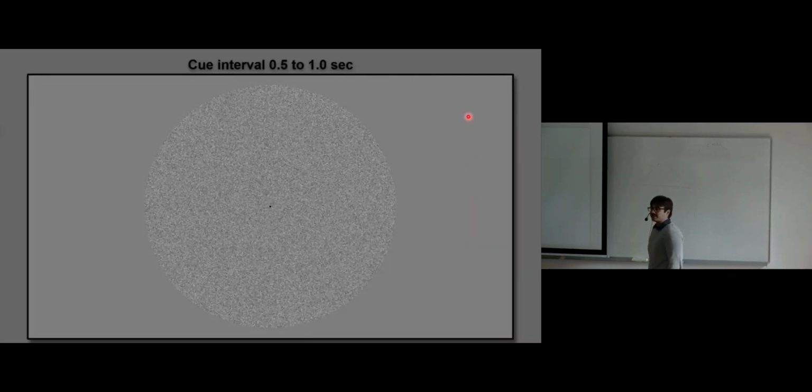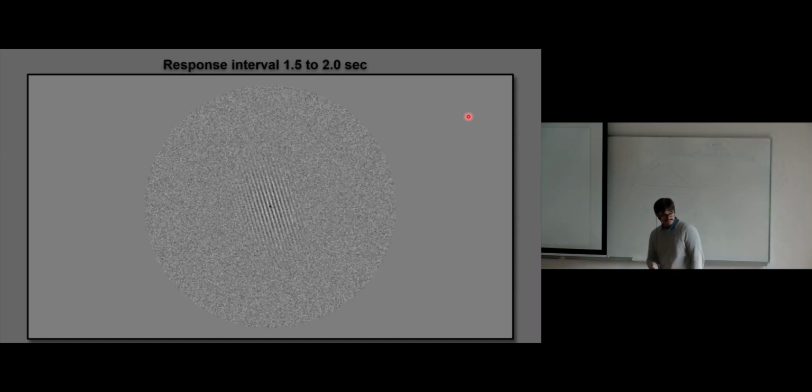So let's start off with a guiding experiment. This is an experiment that we're doing in the lab, but also something I collected at the University of California, Irvine. Say you first see visual noise on an experimental trial, something that looks like an old TV that's out of service, so it's changing fuzzy noise.